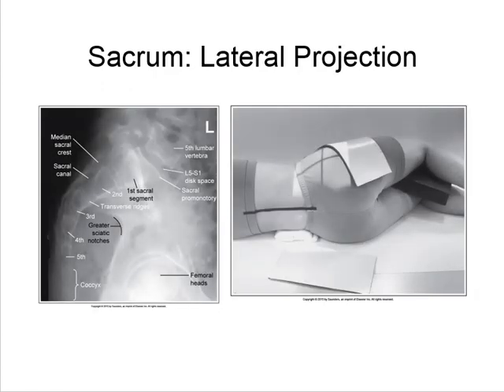So for the lateral sacrum and coccyx, you can look back on page 488-ish of your Merrill's. I think this is the new edition, so the pages may not line up perfectly. But they give you a really good localization for where the sacrum and the coccyx are from a lateral perspective.